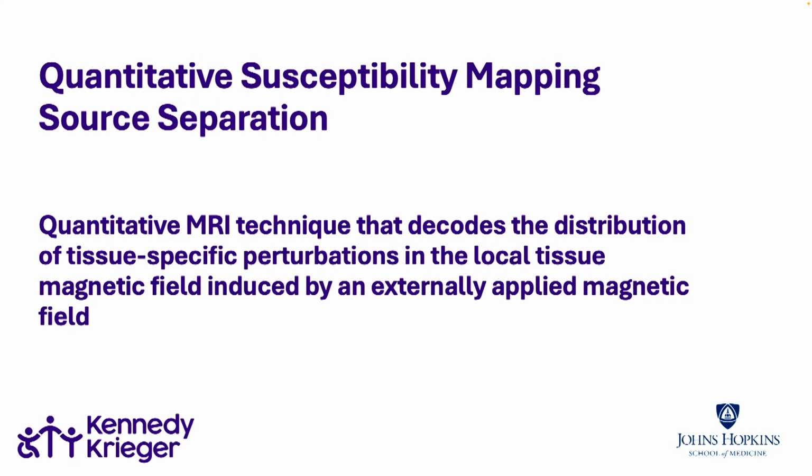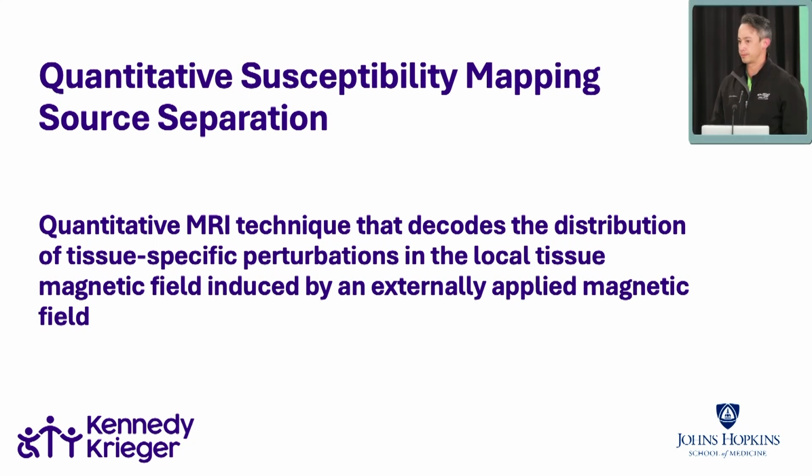Quantitative MRI technique that decodes the distribution of tissue-specific perturbations in the local tissue magnetic field induced by an externally applied magnetic field. So if anybody took physics or organic chemistry in the past, there's going to be a lot of PTSD in this talk. And I gain a little bit of pleasure by torturing everybody because I had to go through it. So.